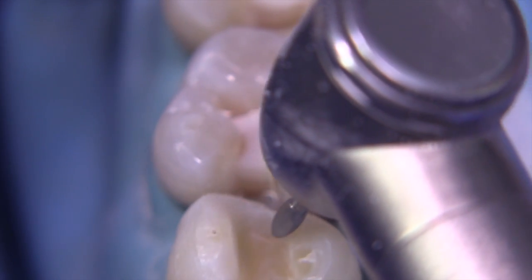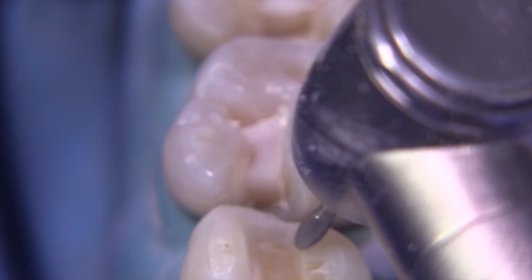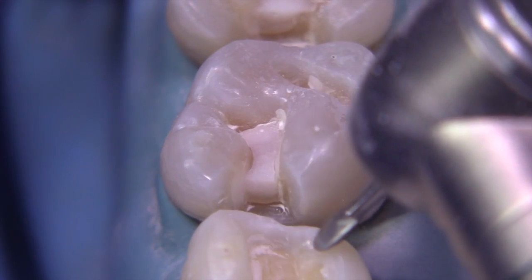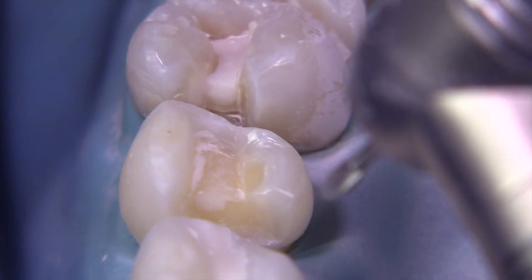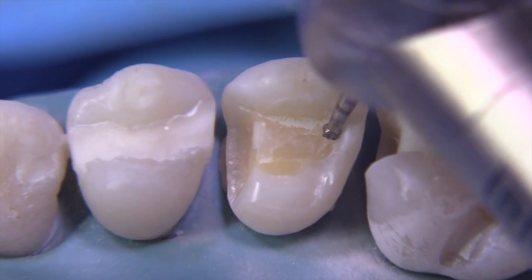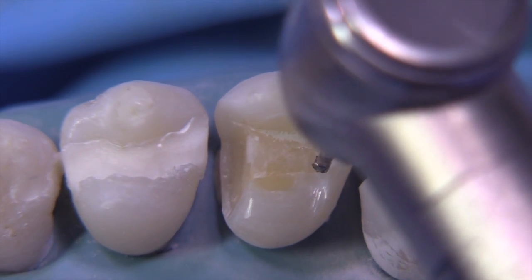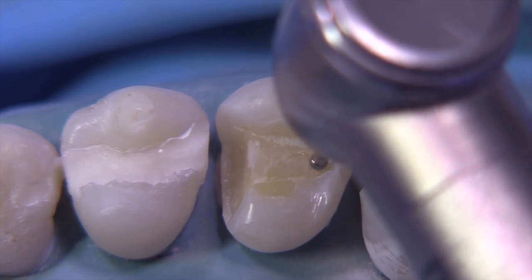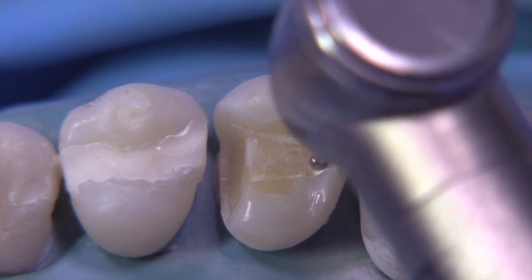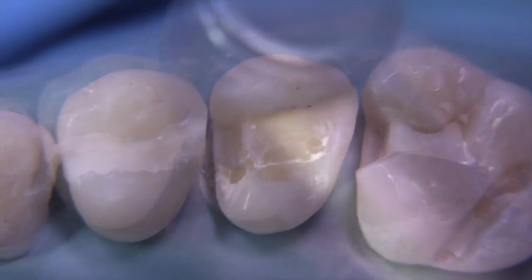Turning the angle here a little bit so you can see this little feature, which we call the channel. You always need to have an area of bulk when you transition between an inlay and an onlay, whether it's ceramic or gold, because you don't want to have that area too thin where you make this immediate transition from an inlay to an onlay. Like the countersink we performed on tooth number 15, we're going to place additional retention and resistance features here. So this is going to start with a little countersink — you could use a four-round or even a two-round — to get an idea of where to place it, always in dentin and never near the pulp.